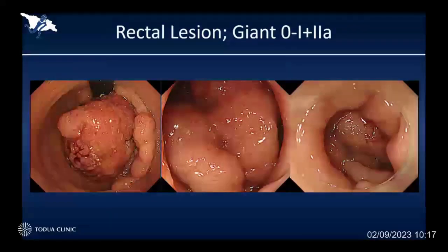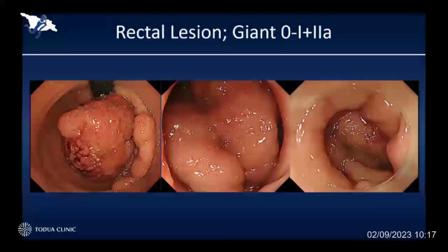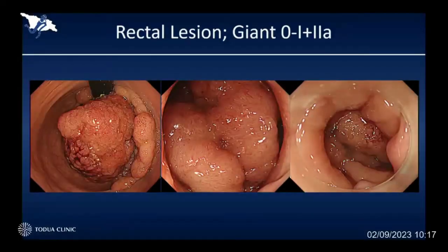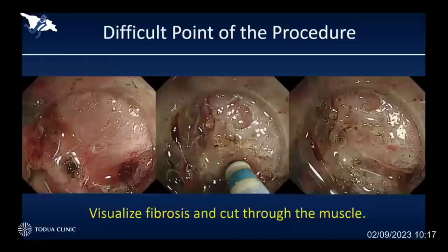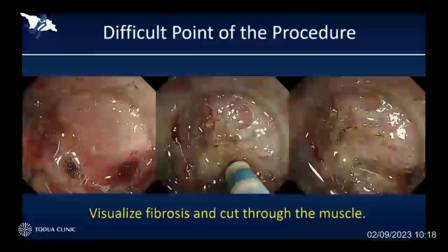This is such a case. As you can see, there is a really big protrusion located at the lower rectum, and the lesion itself was very big, extending more than two-thirds of the circumference. Because of the big polypoid protrusion, it caused really severe fibrosis. So in case of having severe fibrosis or muscle traction, we should cut through the muscle itself. It is quite challenging but still possible, especially for a big lesion located at the lower rectum, in order to spare the anal function.